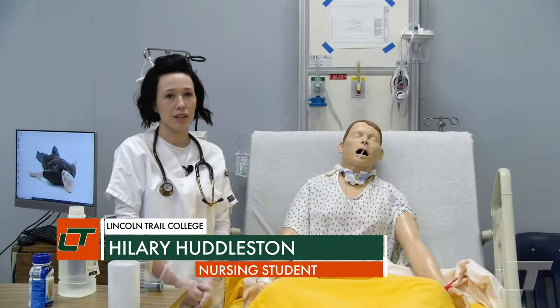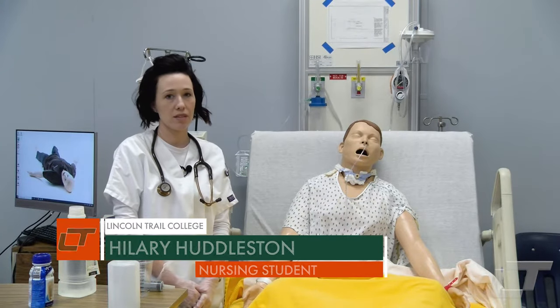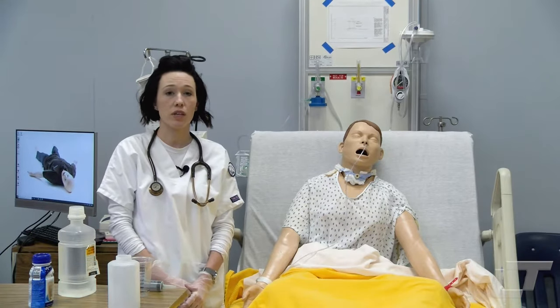Hi, I'm Hillary Huddleston. I'm a student at Lincoln Trail College in the nursing program, and today I'm going to be demonstrating how to give a bolus feeding through an NG tube.